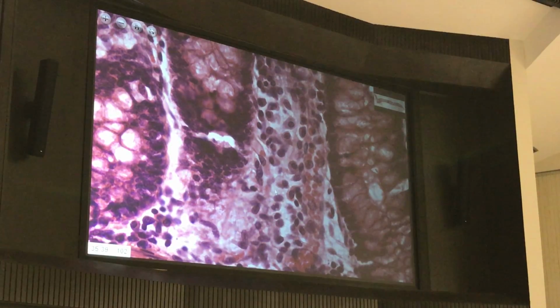In the small intestine, we're absorbing lots of the things that we want, right? As we go further in the tract, that's things that our body has not taken up. It's going to be waste. And so as you go further down, you will see more immune cells, basically to take up any bugs or debris or anything in the system that we might want to protect ourselves against. It is true that you see more immune cells nearer openings in the body.